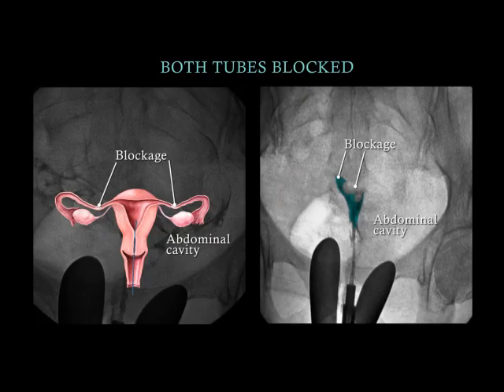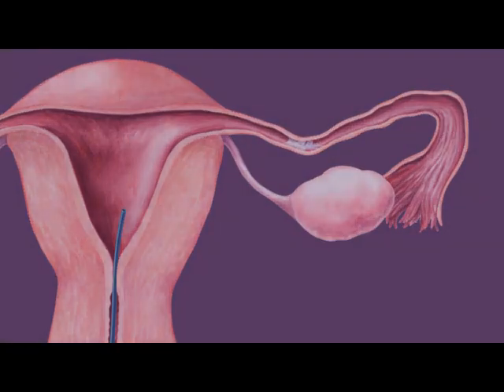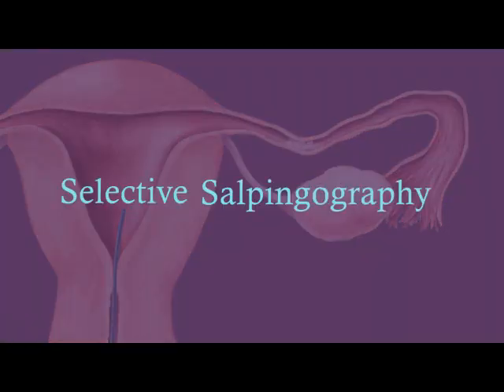In some cases, blockage can occur in both fallopian tubes. Notice that the dye will remain within the endometrial cavity. When the blockage is confirmed, a selective salpingography can be performed.